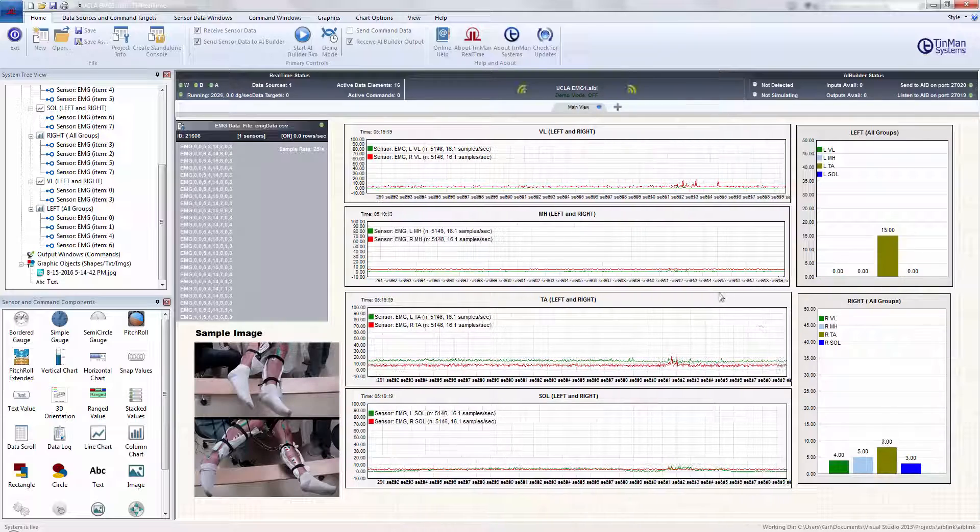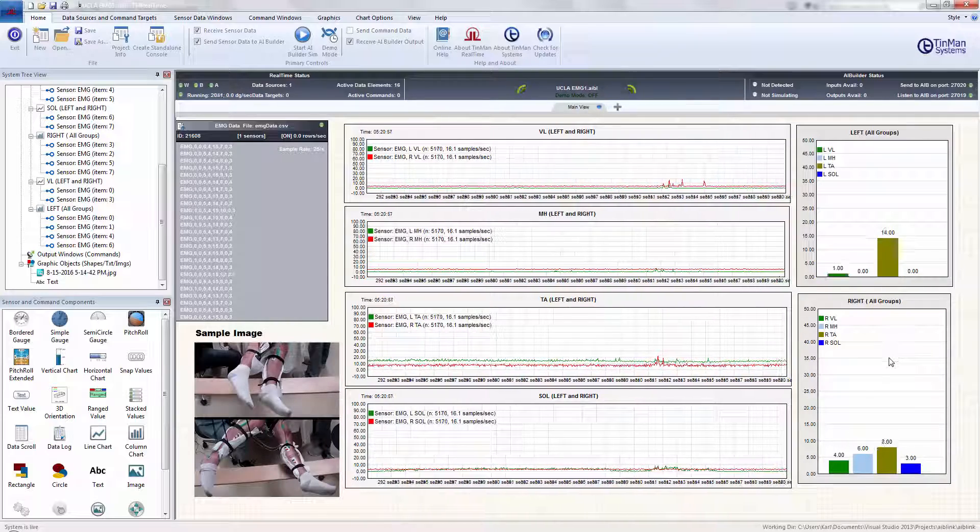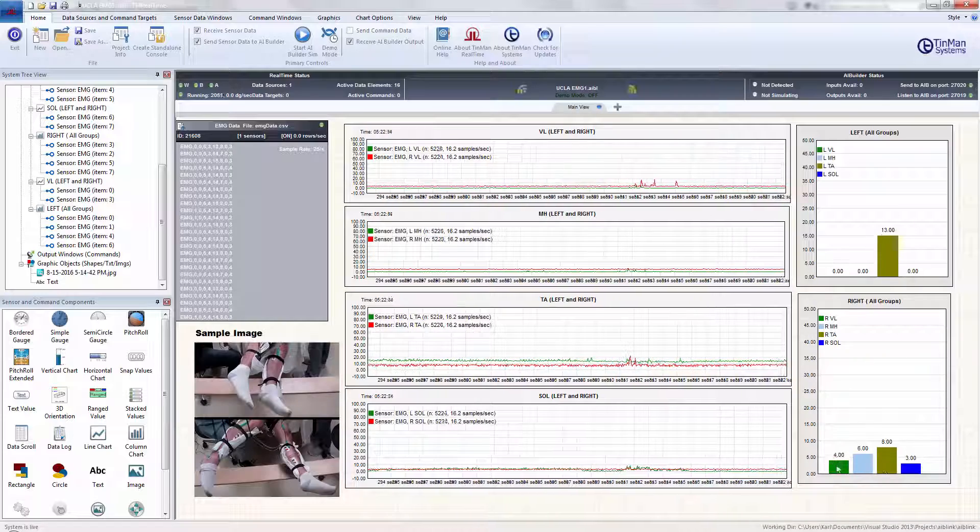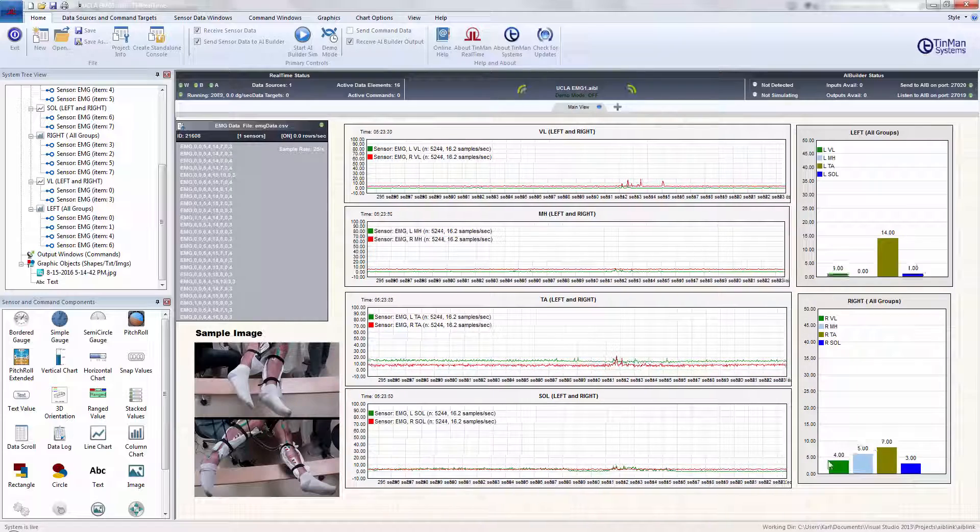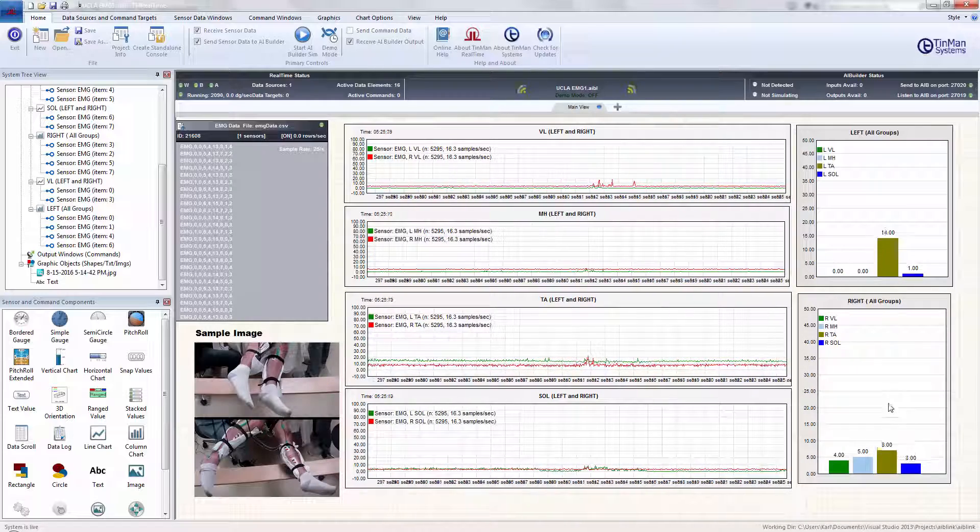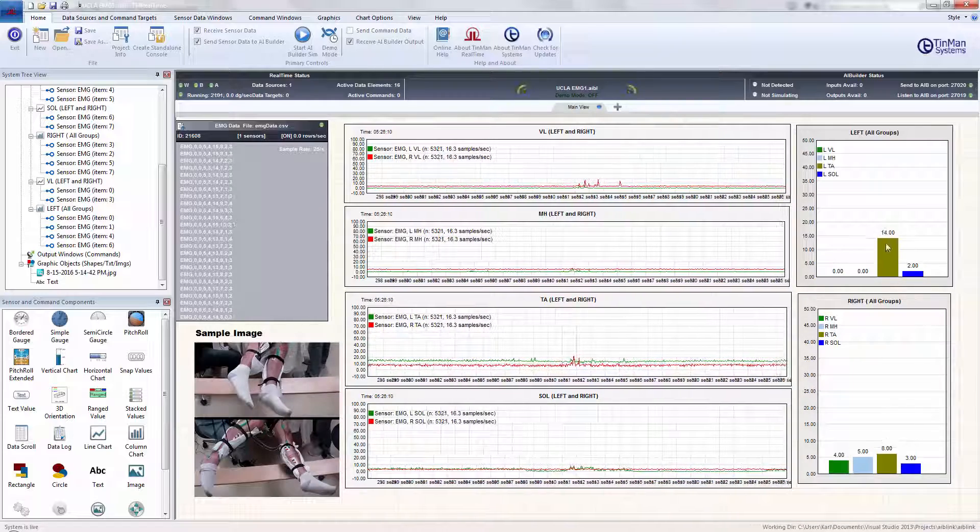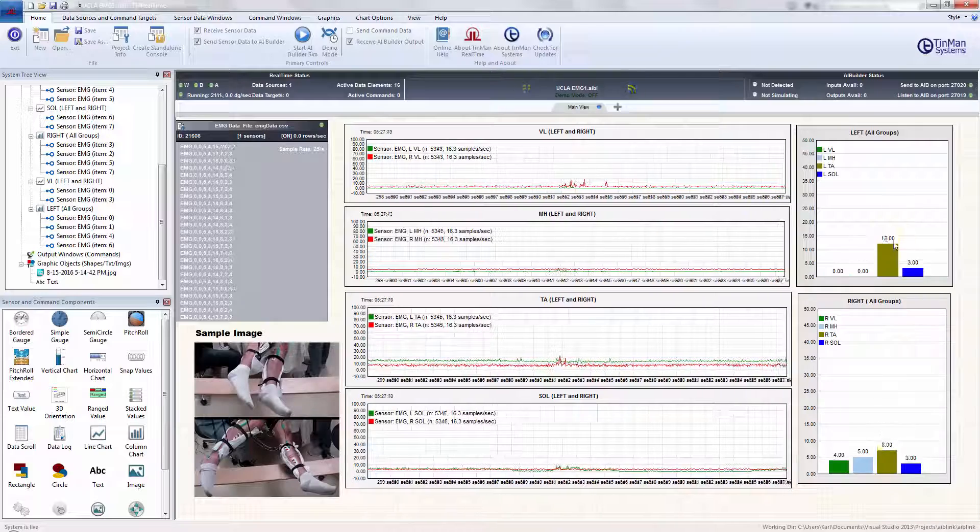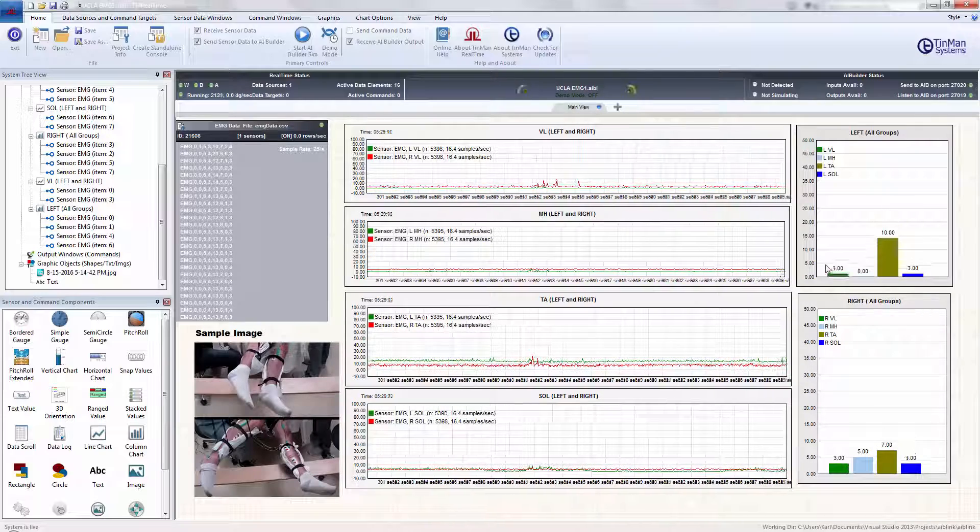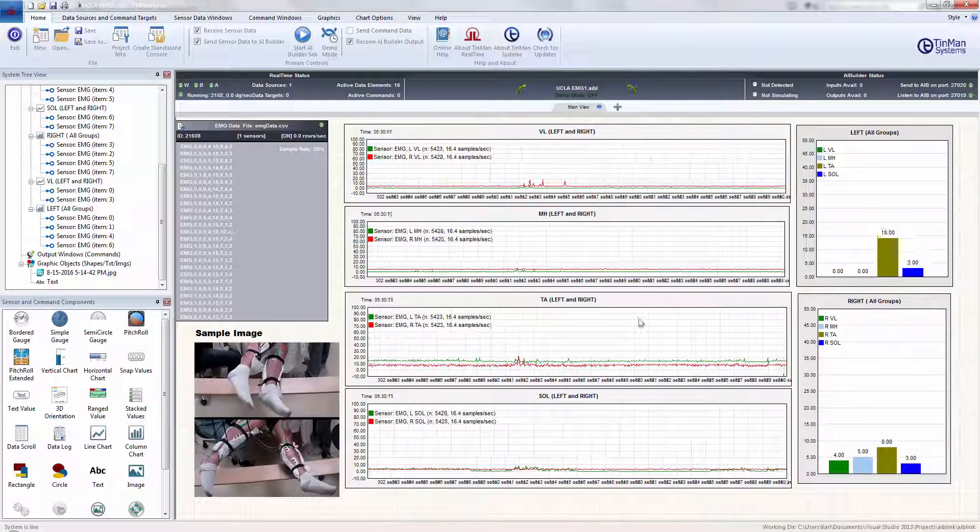Everything else seems to be, well, I guess the right side, you have fairly constant activity across all four muscle groups. Whereas on the left side, only in that one muscle group, which is kind of interesting.